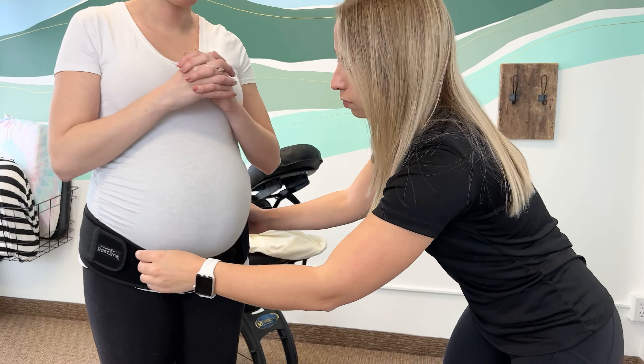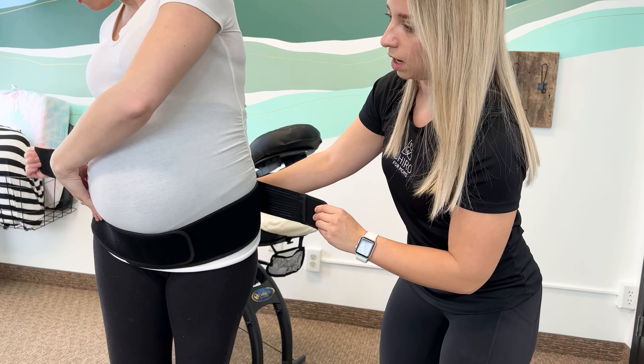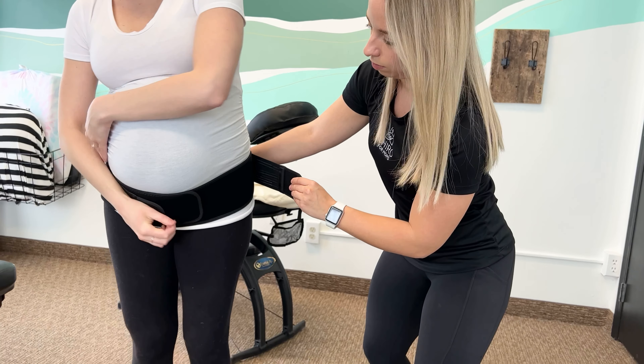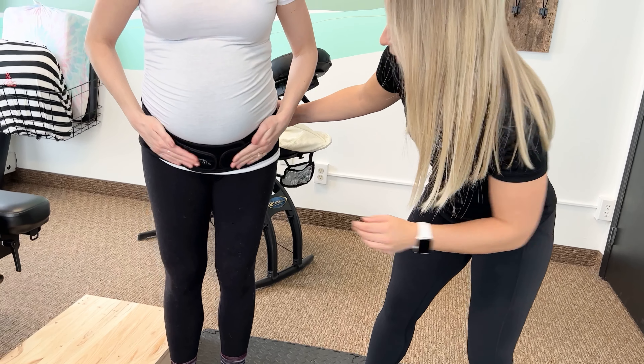Spin this way one more time and then I'll have you do it. We can tighten this even further using these extra straps, and you can kind of push it to your comfort. And then same thing with this one.